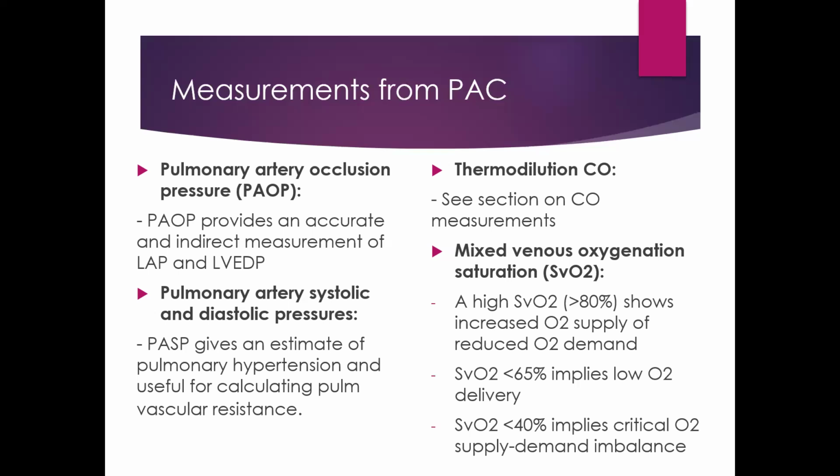Thermodilution, you can use that with the measurement of the temperature change of your injectate. It can be used to measure your cardiac output. You will see that in the subsequent slide.